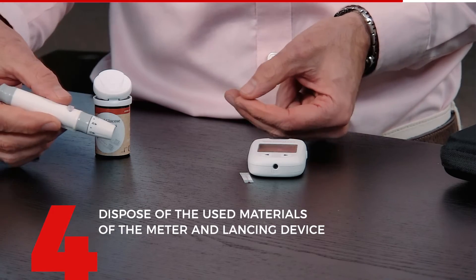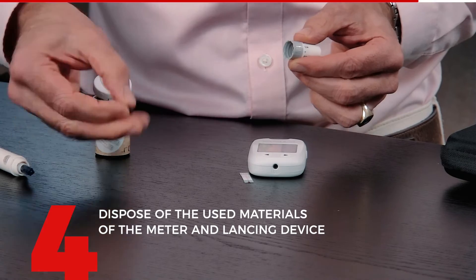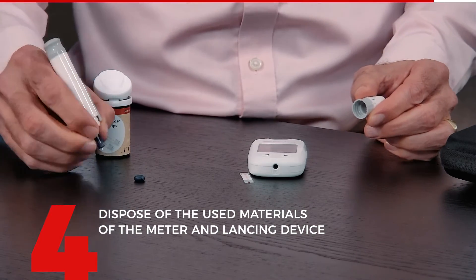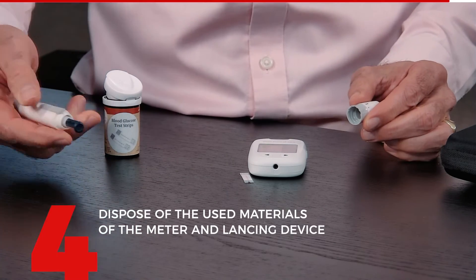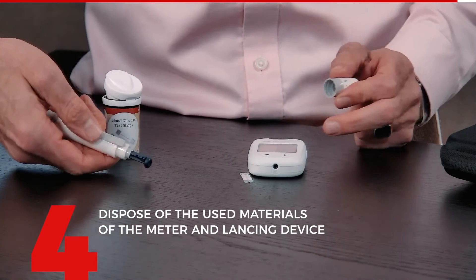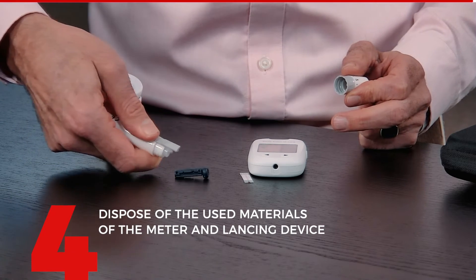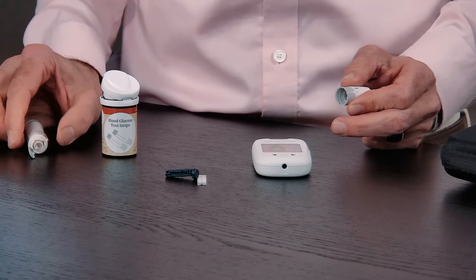Remember the lancet is still in here. Open it, take the little cap that you had before, put it on here so that the needle is protected. Now you can use the ejector to eject that and throw away those two things. You're all done.